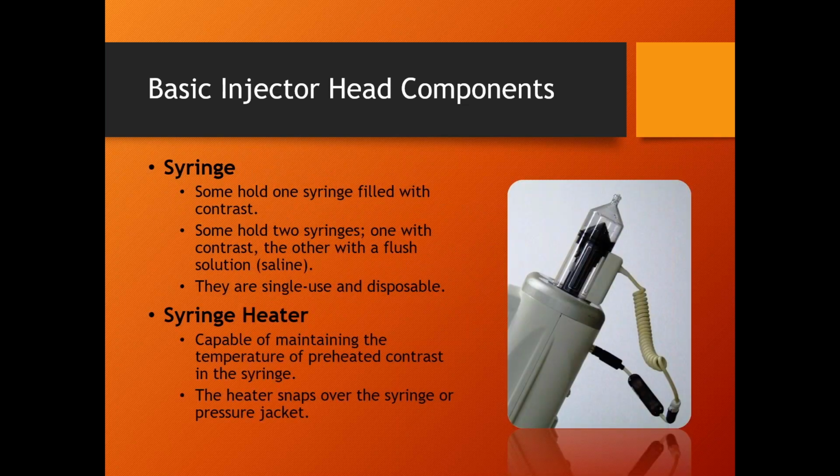If we look here, I know it's going to be hard to see for some, but my two syringes, the green one is contrast and the blue one is saline. That's my A and B syringe. This first row where it's in green is 1 and 1. The green means it's contrast, my green syringe. I'm going to select my flow rate here, we'll say 5, and my volume, we'll say 20.